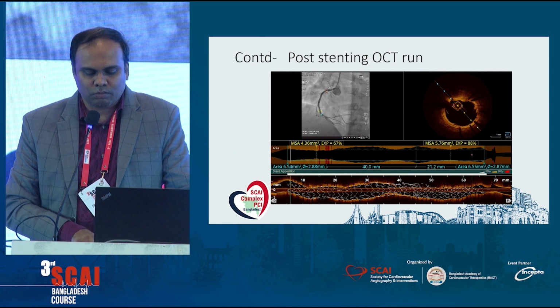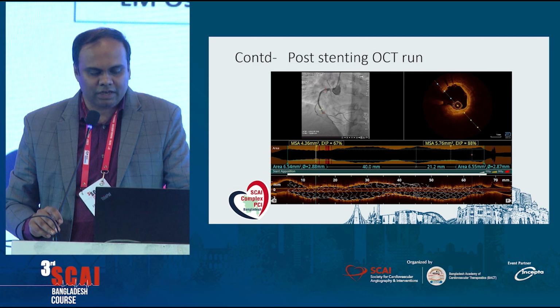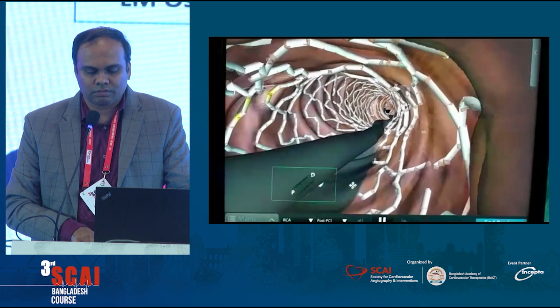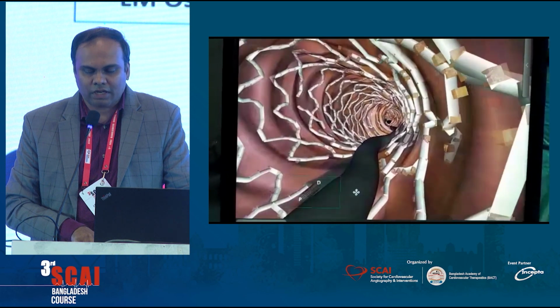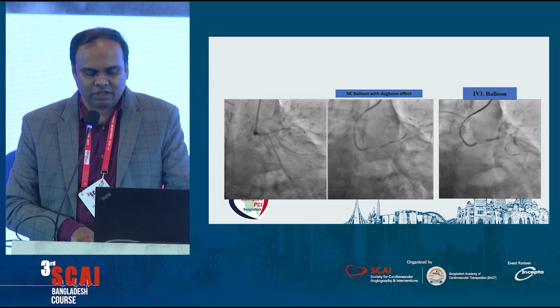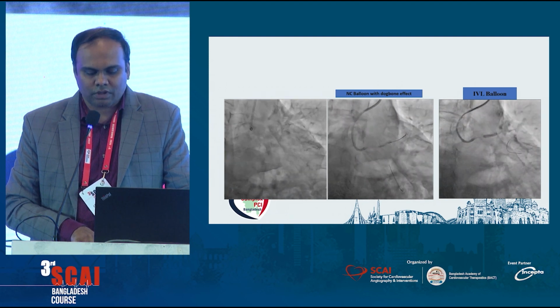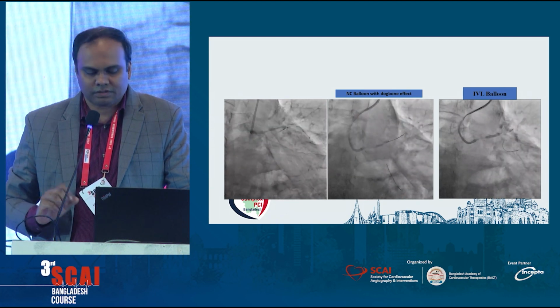We only went for plain balloon angioplasty there, and then we did an IVUS run in the LAD, which shows significant calcium, in some parts 360 degrees. After adequate pre-dilation and IVL, we put the stent from LM to LAD with crossover stenting, and post-dilation was done with a 1:1 balloon. This is the final result, with a good appreciable outcome.